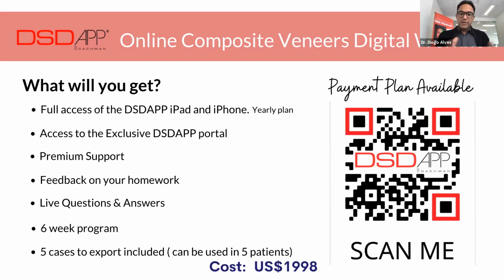So basically, you guys saw that I was exporting these cases from the app. When we say 5 cases, it doesn't mean that I can only export 5 files. It means that I can export files from 5 patients. So included in your package, you'll be using 1 case because that will be your homework, and that will be your real patient where we will be helping you. But after that, you can use it in 4 more patients, which is already included in your package.